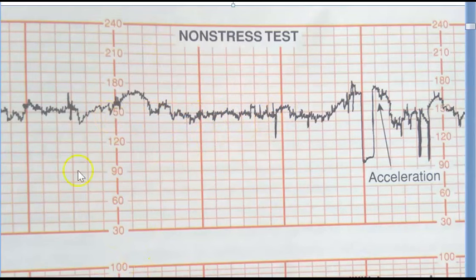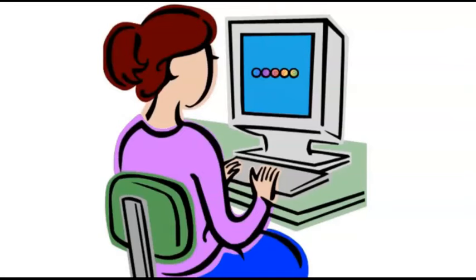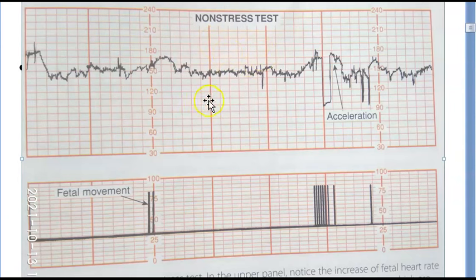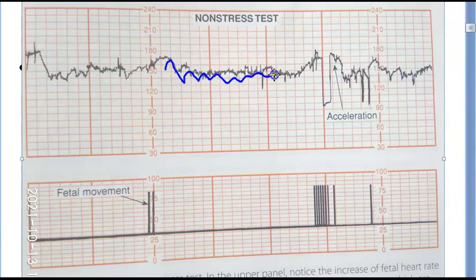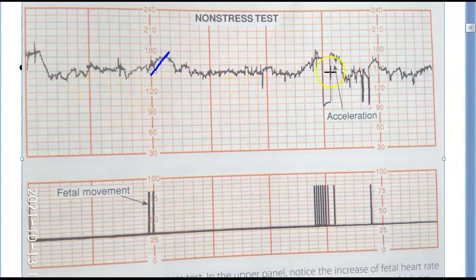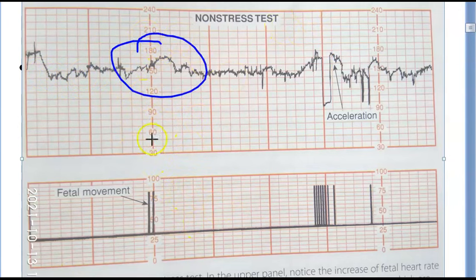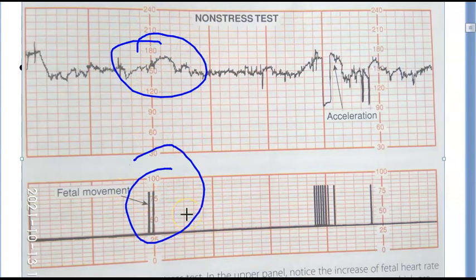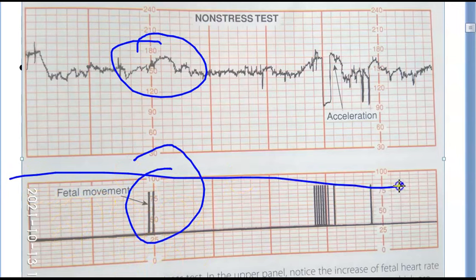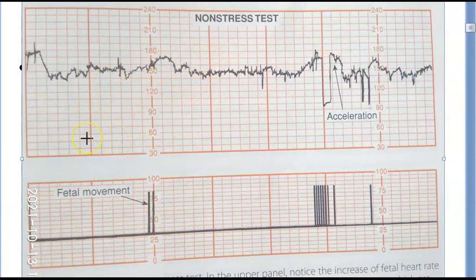The non-stress test is giving you information about the fetal heart rate. What you're noticing is that the fetal heart rate is varying — which is good. There is an acceleration here. An acceleration means the heart rate is increasing. This acceleration corresponds to fetal movement — when the fetus moves, its heart rate increases, so there will be an acceleration.